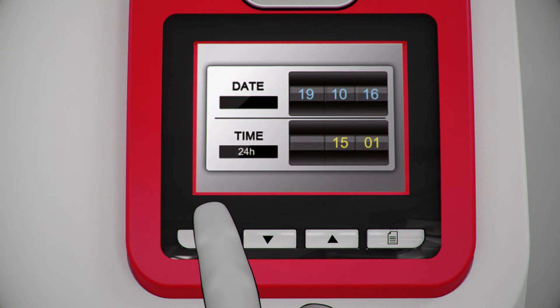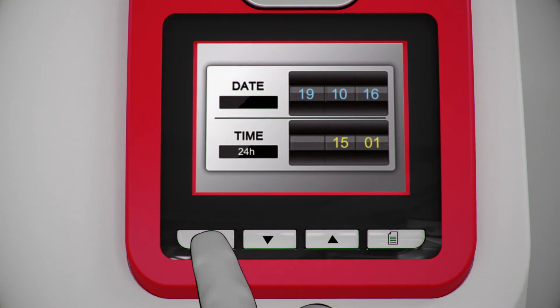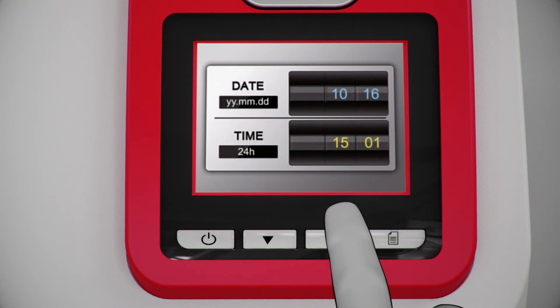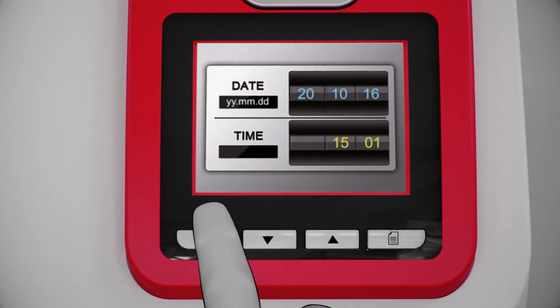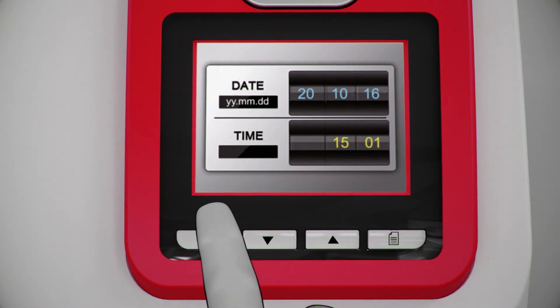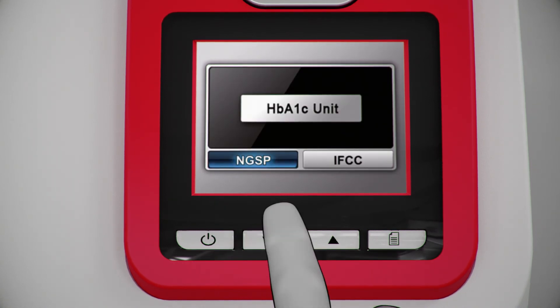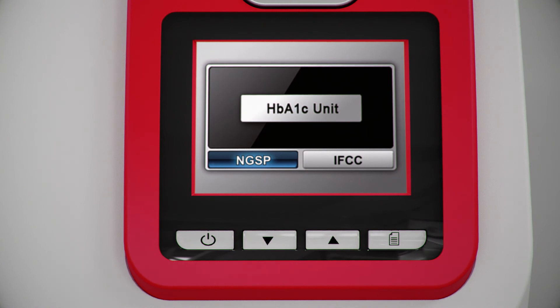Select date format by pressing the arrow keys and press mode to select format. Set the date by using the arrow keys. Select time format by using the arrow keys and choose 12 hour or 24 hour by pressing mode. Select unit for test result by using the arrow keys, then press the mode button to select unit.